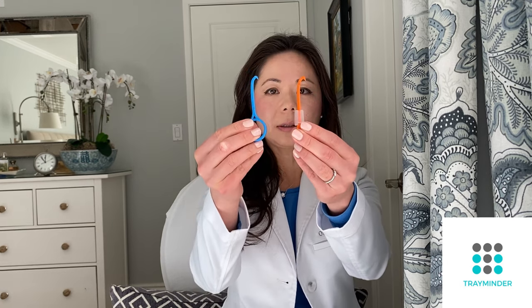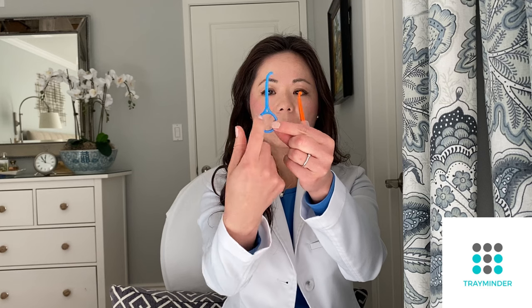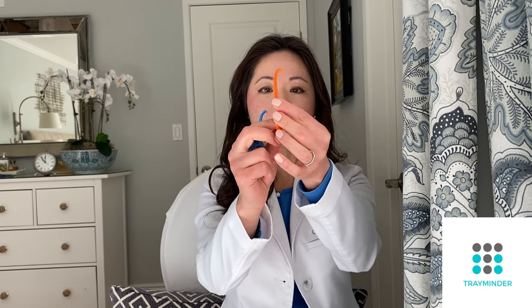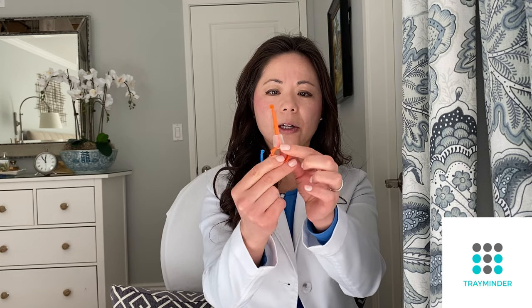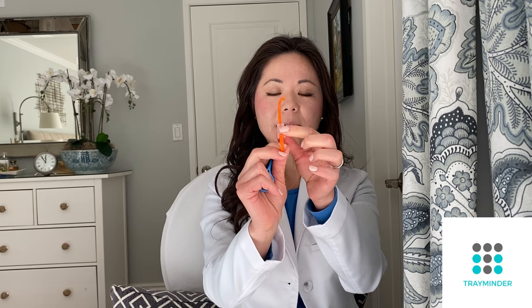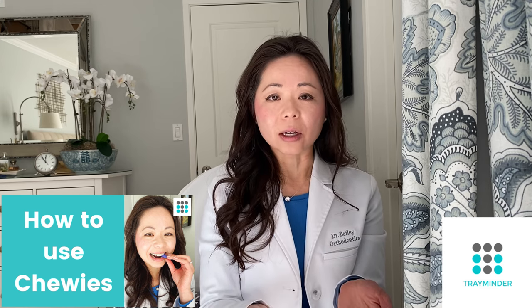The other one is called the Pull Tool. They're shaped almost identically. For the Ortho Key, the circle goes this way, and for the Pull Tool it's the same direction. The Pull Tool has a silicone tab attached, and the idea is that you can use it as a chewy — a chew tool — to help seat your aligners. I have a video on chewing exercises linked below that explains the rationale behind using a chewing tool.